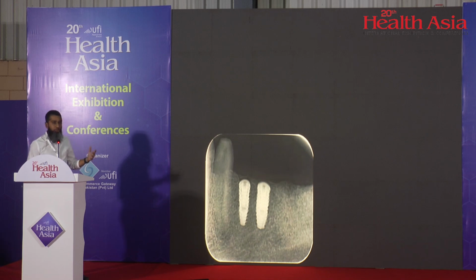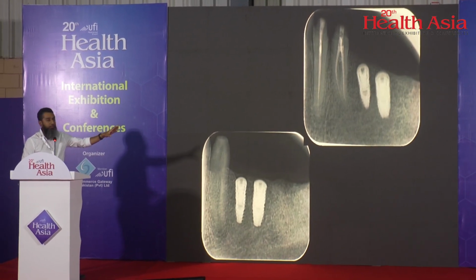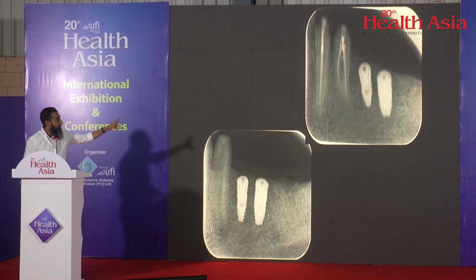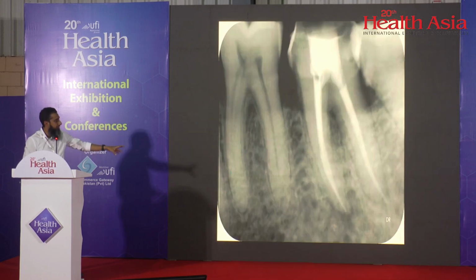Before ending, I'll just show you a couple of cases to see how with Rotary you can get good results easily. So here also you can see in the premolar, don't look at the implants, but the premolar here, following the curvatures becomes easy with Rotary endodontics. In every case, you will see the curvatures and the shape that can be followed in a better way with Rotary endodontics. Okay? Thank you very much.